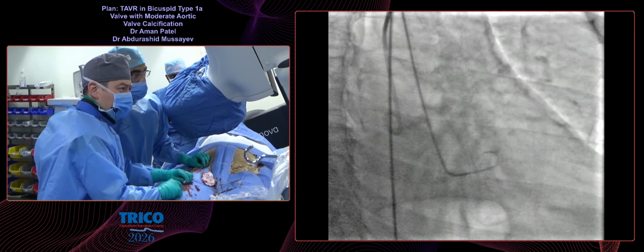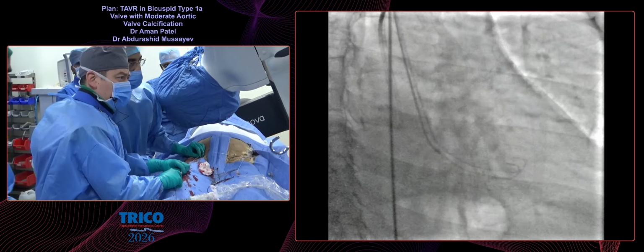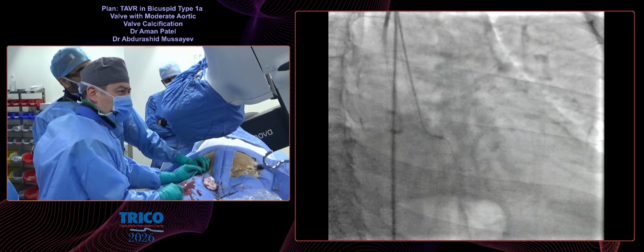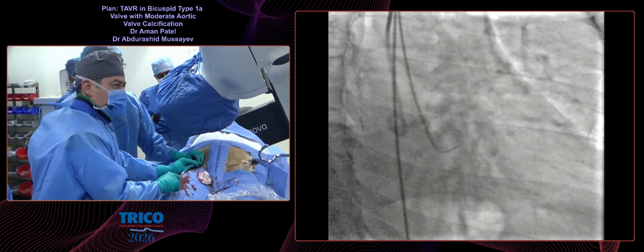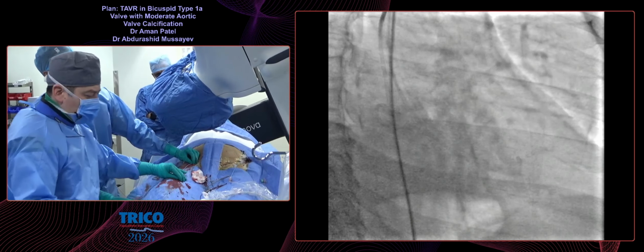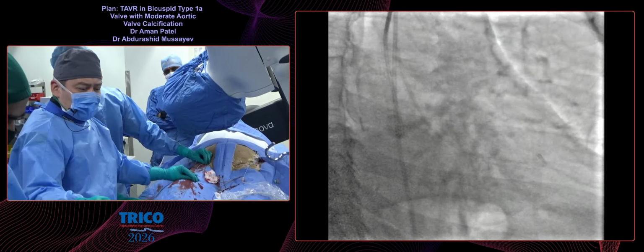So if there was a concern at baseline, would you have put a temporary pacing wire in? Normally if we do this wire-based pacing, then before the procedure ends, if we feel that the patient may require a pacemaker, we implant a temporary pacemaker from the jugular access.